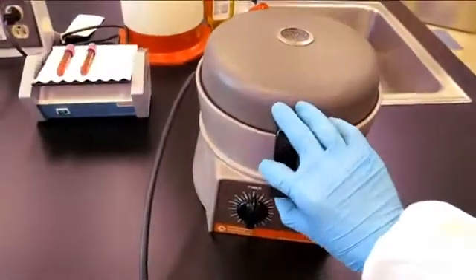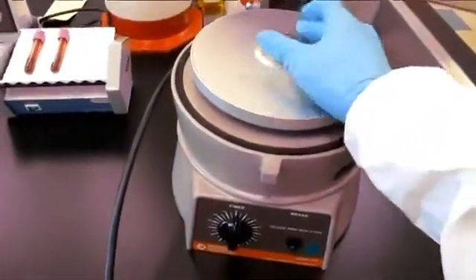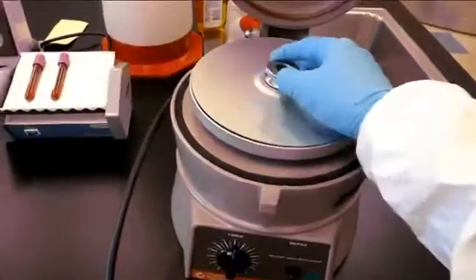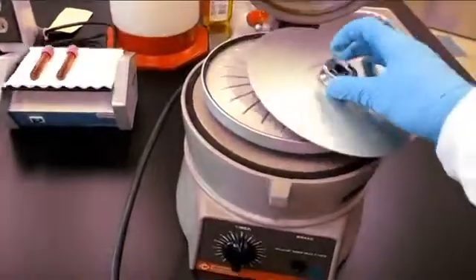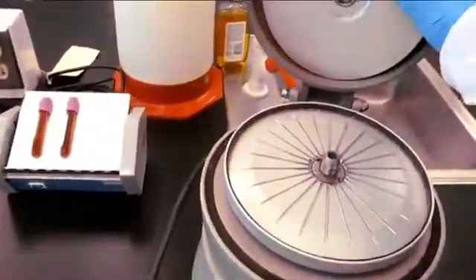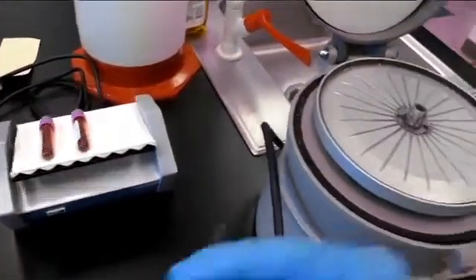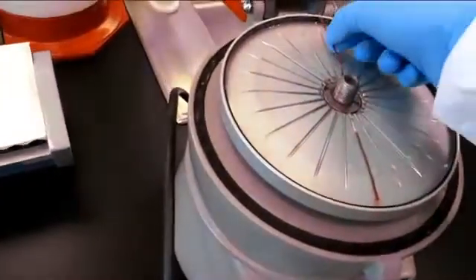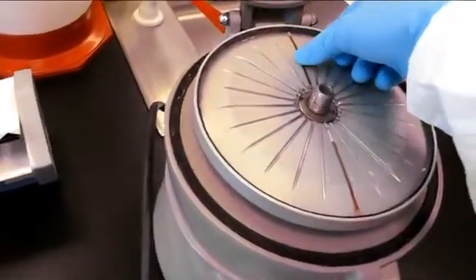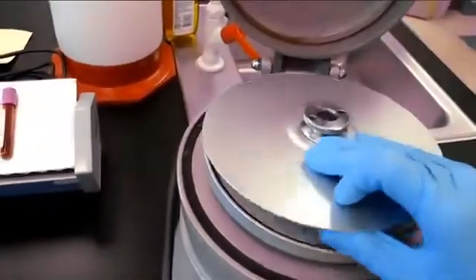The sample is now ready to be placed in the micro-hematocrit centrifuge. Lift the top and unscrew the cover. Rest the cover on the top to ensure you will not forget to screw it back on later. The samples will need to be balanced before centrifuging; this can simply be done by placing them on opposite sides. Make sure to note the slot number that your sample is inserted to. The side with the clay should be facing the outside, or else the blood will leak out when centrifuging.